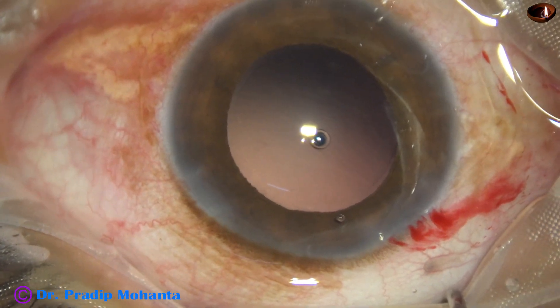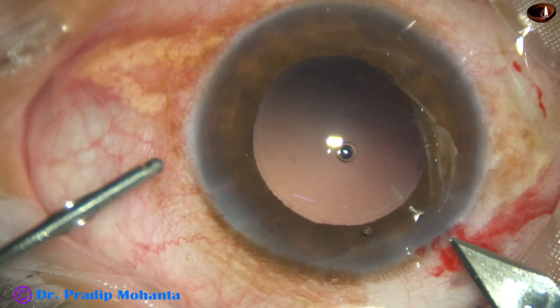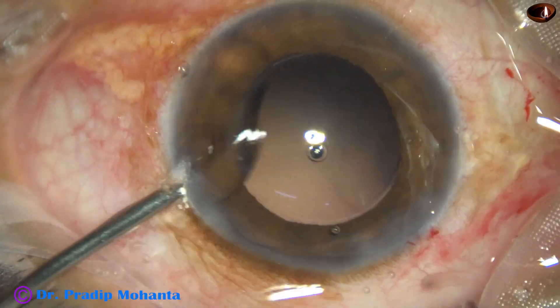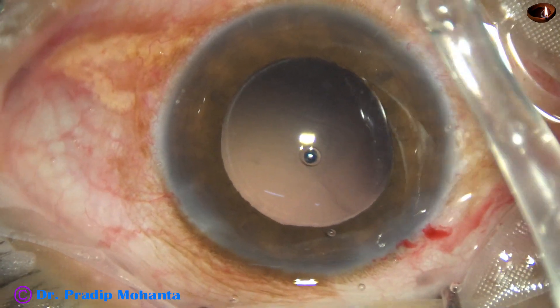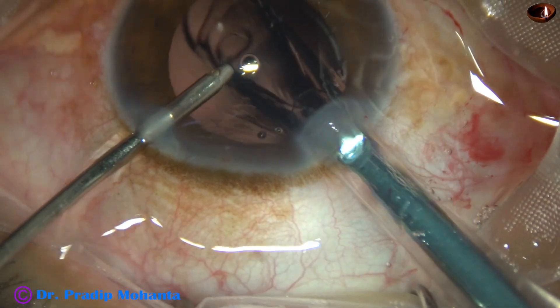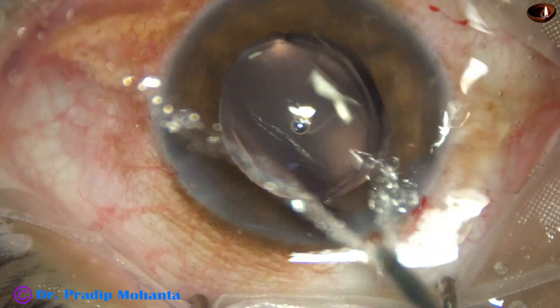Cortical cleanup is done and now is the time to implant an intraocular lens. I am using a bicartridge, so I am enlarging the main wound by 0.1 mm — the main wound is now about 2.9 mm. Hydro-implantation of a single-piece monofocal intraocular lens is done. Both the haptics are in the capsular bag.